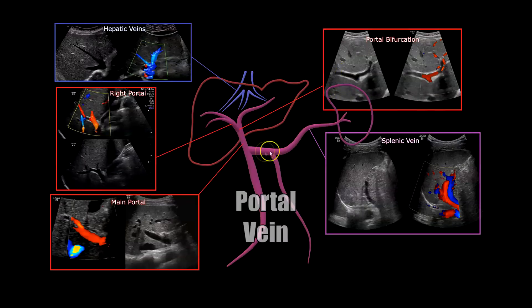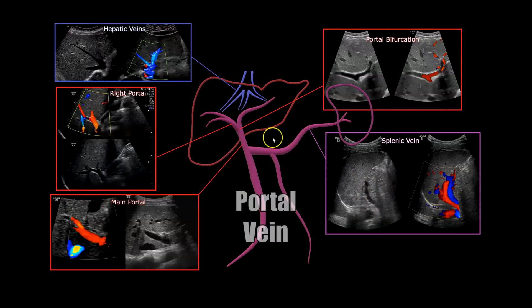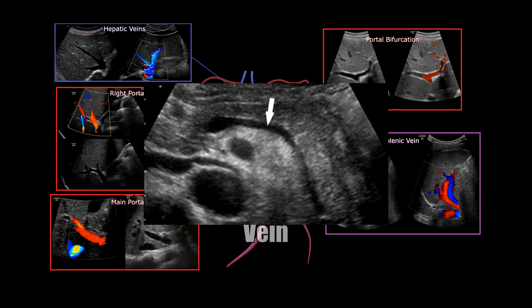The splenic vein would be right here at the splenic hilum. You can see the vein, and that's color Doppler showing the vein and artery. You can also get the splenic vein near the pancreas — the pancreas tail ends at the splenic hilum, and you can Doppler the splenic vein there as it becomes the portal vein at the portal-splenic confluence.